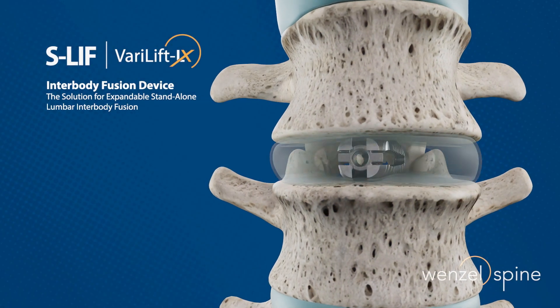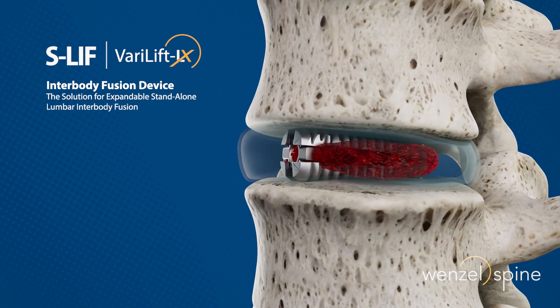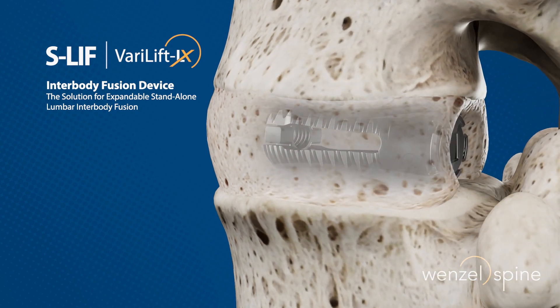The S-LIF procedure using the Verilift LX interbody fusion device is the only posterior expandable implant cleared by the FDA for stand-alone use without supplemental fixation.